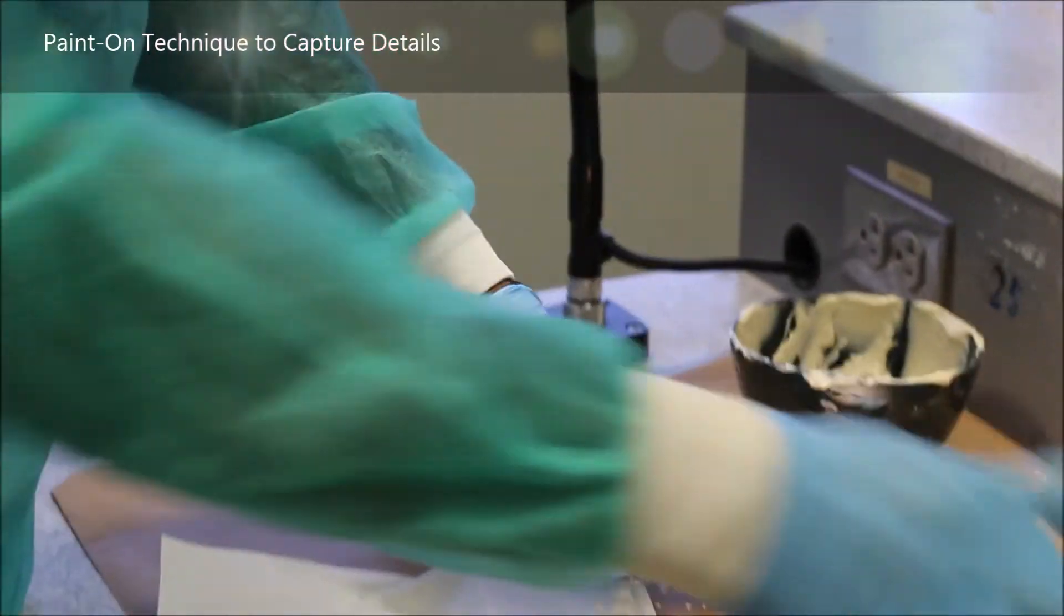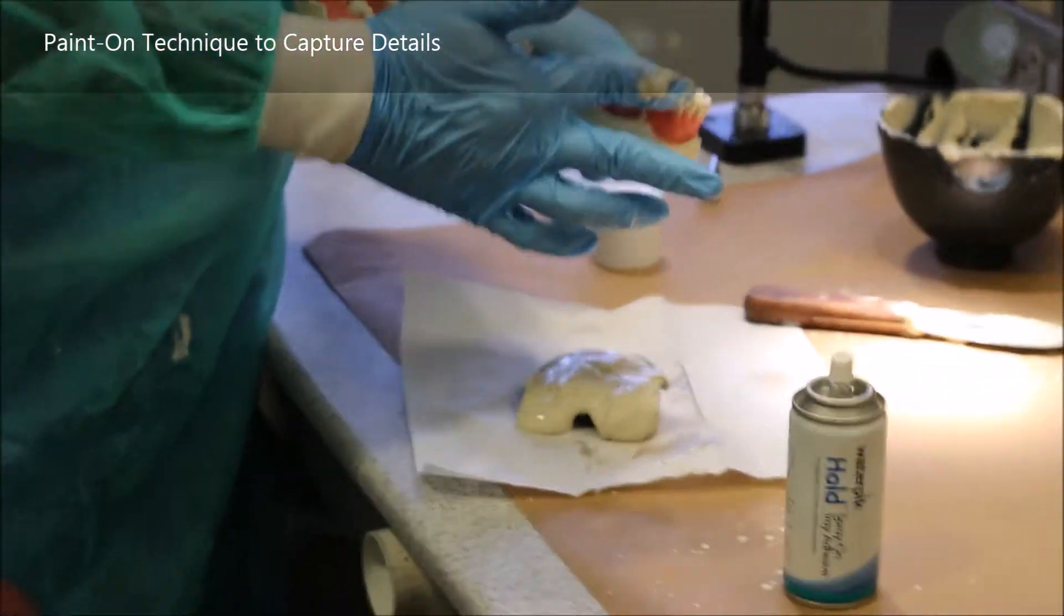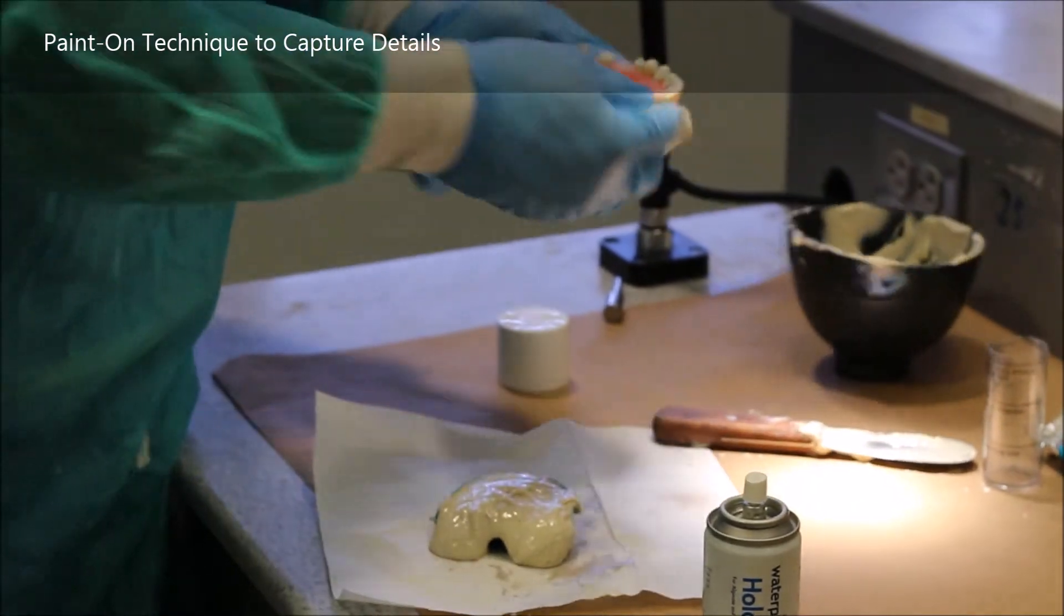In any case, the important thing here is that you just want to load the tray. You don't need to have it be pretty.